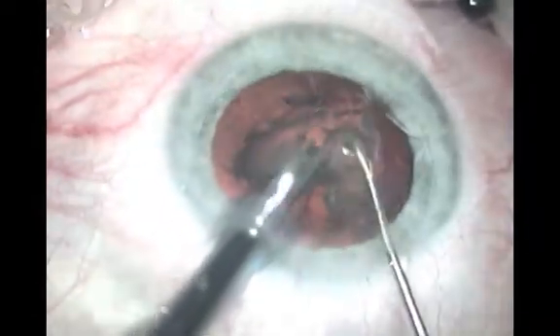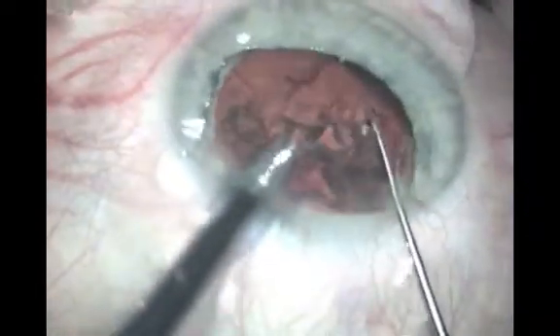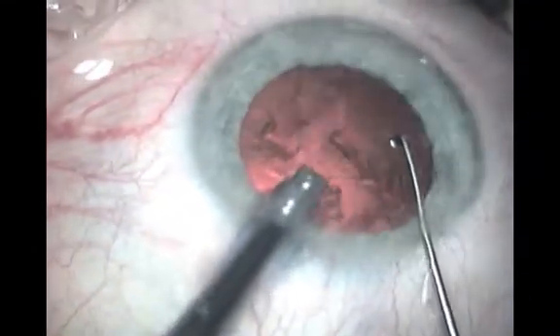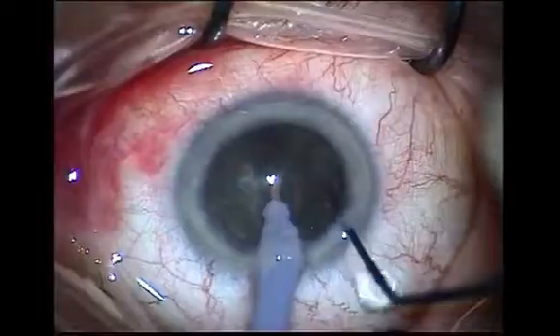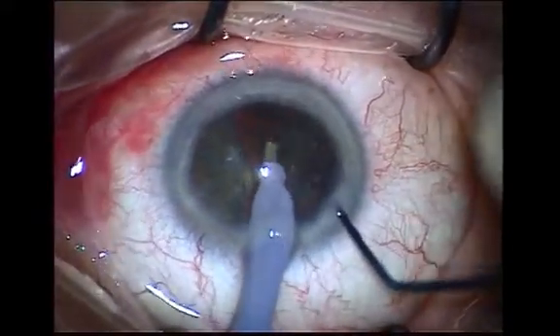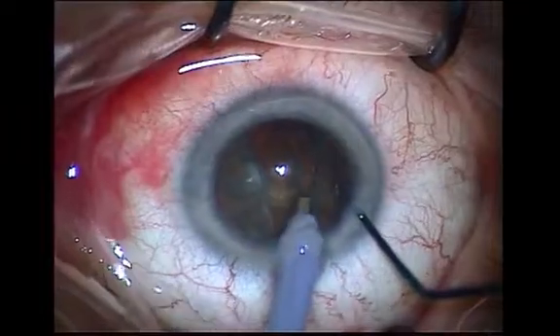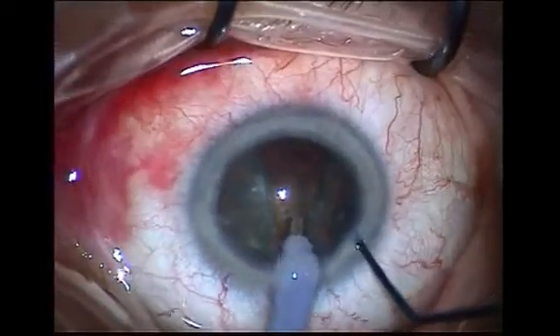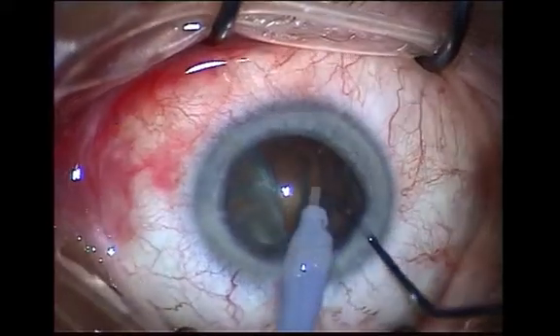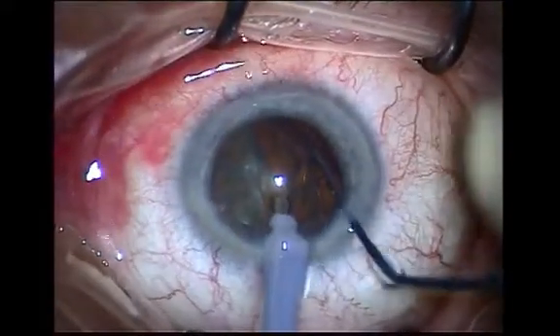Now change to high vacuum but still low phaco power. Engage one half of the cataract at an extremity, which is easier if properly divided, but the cataract can still be manipulated with the other instrument. With high vacuum, take the nucleus out without phaco power — even if the lens has not split, it usually aspirates and breaks at the site of the groove.